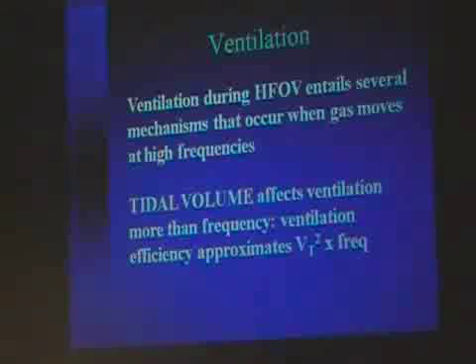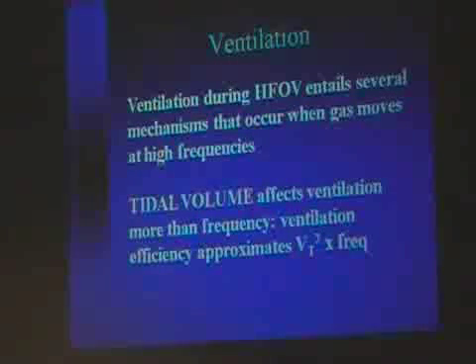So let's talk now about ventilation. Ventilation during HFOV entails several mechanisms that occur when gas moves at high frequency. And this is a board question, and I gave it to a small test last year to the fellows, and nobody got it right. So please remember that tidal volume affects ventilation more than frequency during high-frequency ventilation. The efficiency of ventilation approximates tidal volume squared times frequency, and that's been shown over and over. This guy by the name of Jose Venegas, who's probably the smartest guy in the world in terms of mathematical pulmonary mechanics, showed this, and this has been shown over and over again. Tidal volume is more important than frequency during high-frequency ventilation.